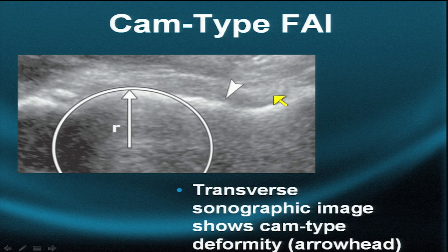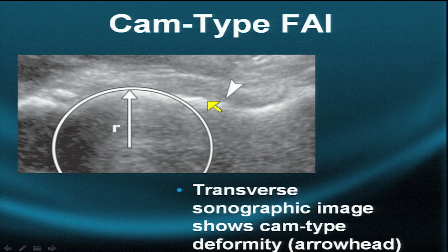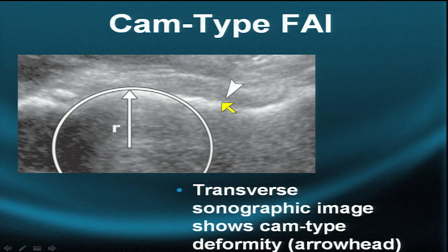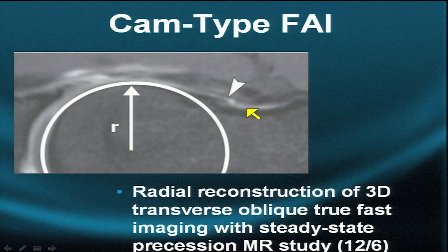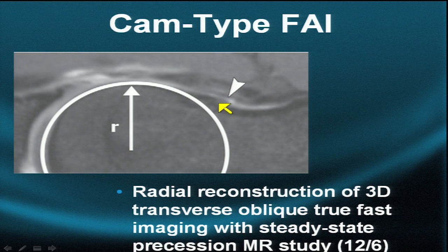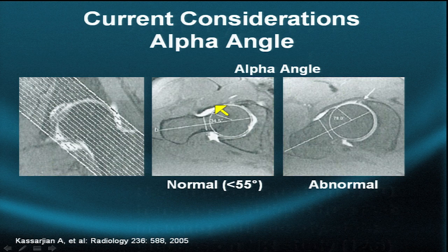This transverse oblique sonogram demonstrates the transition between the neck and the head, showing a little bit of thickening at the head-neck junction consistent with early bumps — bumps in cam type impingement. Here are the same bumps seen on a radial paraxial reconstruction at the femoral head-neck junction: so-called loss of sphericity, so-called loss of tapering, as a sign of cam type impingement.